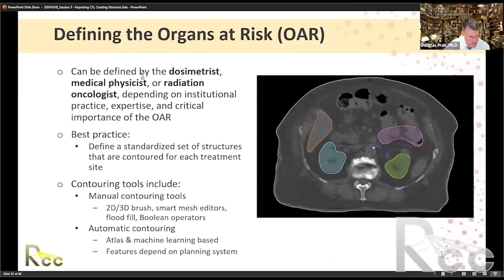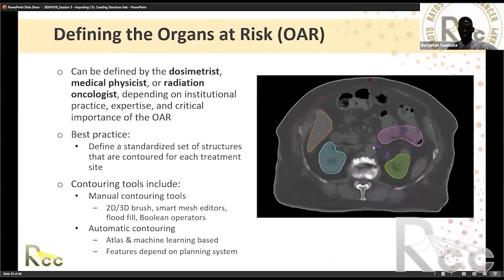So defining organs at risk, in our clinic, this can be defined by a dosimetrist. Oh, I'm sorry. Douglas. Yes.